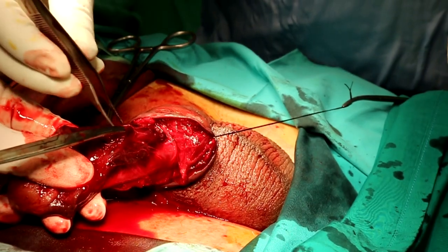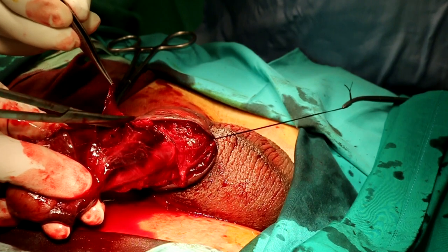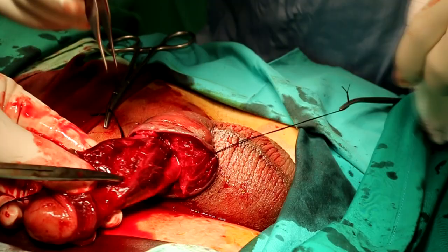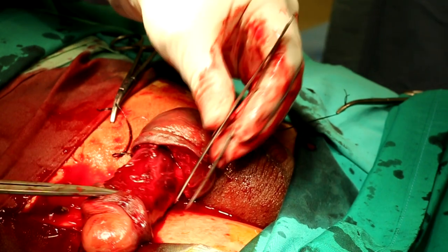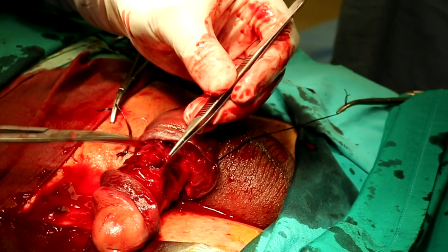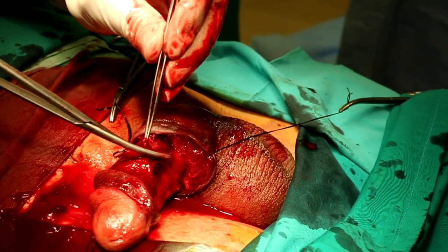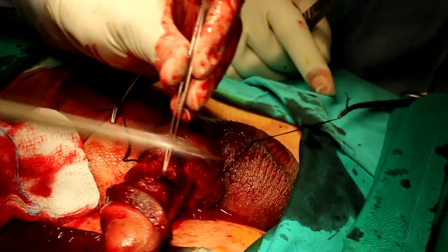So there is no classic way to evacuate it, but I just started step by step, evacuating the hematoma, cutting the fascia, and evacuating the hematoma. See, now the hematoma is almost done, and as you start to see fresh bleeding, you know, now you are close to the tear, close to the corpora.